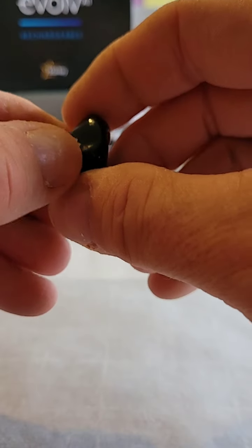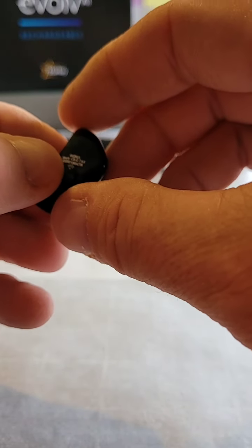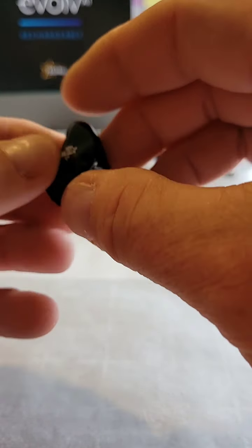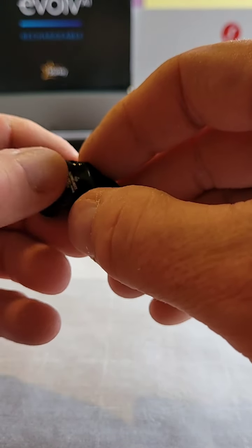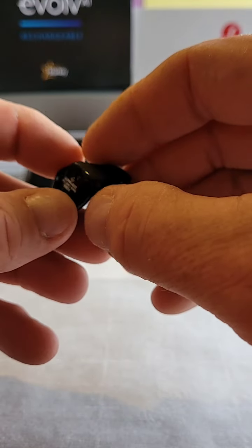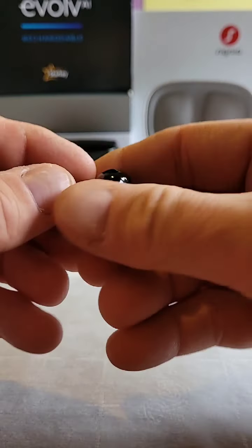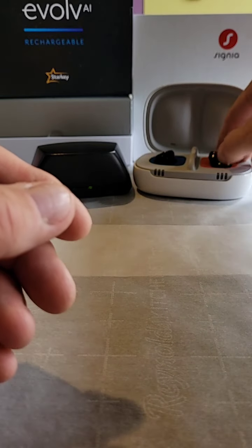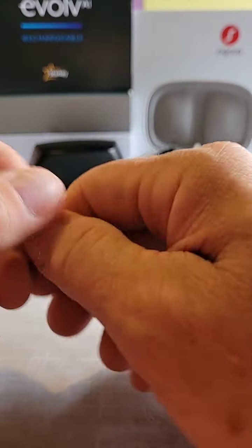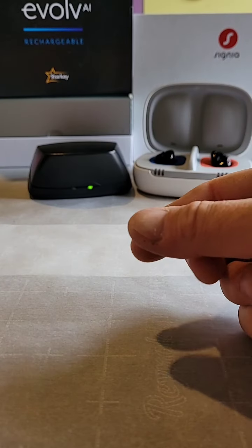Now, I've got brand new glasses, less than 2 weeks old, so my eyes are just about as perfect as they can be. Normally, with my older glasses, I wouldn't have been able to read that. Not that that's a big deal, because both your markings on the Signias and your Evolvs are screen printed, painted, so those are going to wear off. Over time you will adapt and know by picking them up which one goes in your right and which one goes in your left ear. So I do like that. If you have dexterity problems, the Signias may be better because you can grasp them and hold them better.